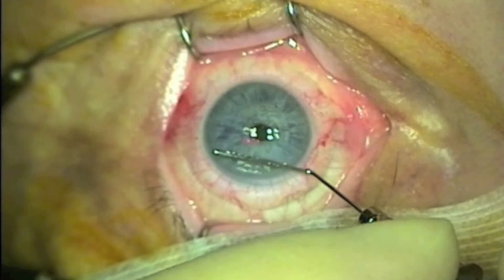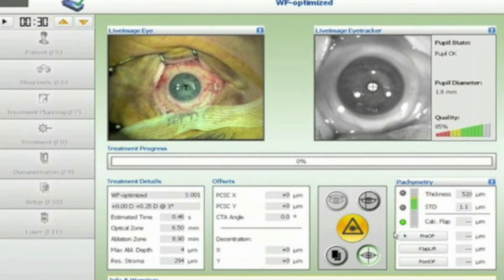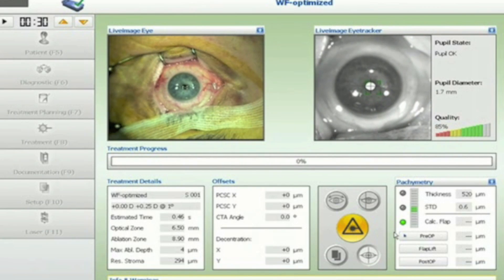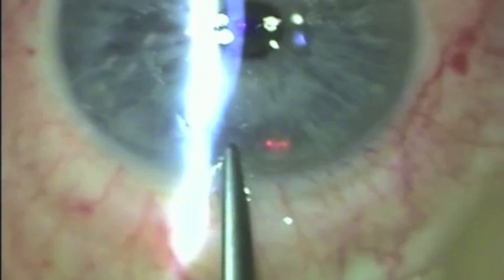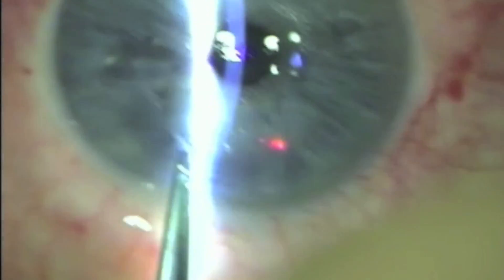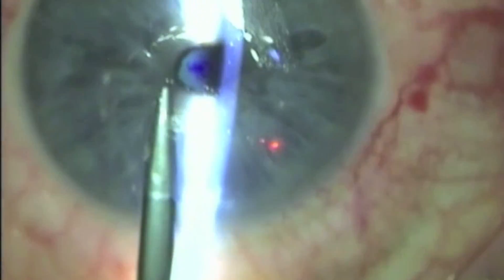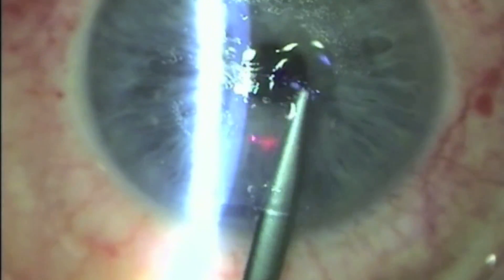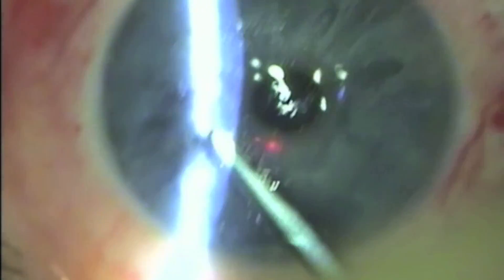The gas bubbles are now gently expressed. The eye tracker is once again engaged to determine where the inlay should be placed. One can see the ink mark where the inlay should be centred. At the 12 o'clock position an attempt is being made to gain access to the channel — this can be quite difficult as it is easy to lift the epithelium. Once access to the channel is achieved, the channel area is cleared in order to gain access to the pocket and all adhesions in this area are freed, creating a space in which it will be easy to manipulate the inlay. One can now see a nice wide central pocket over the pupil with access through the wide channel.